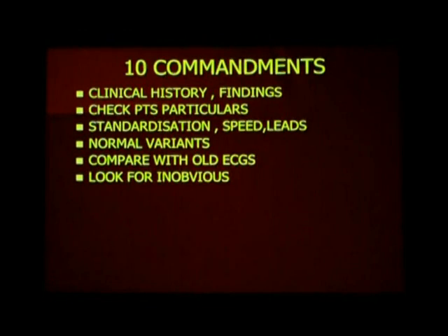Obvious is obvious, look for the inobvious. So the ECG reading dictum is you must not look at what others will diagnose. You must always look at what others will miss. So when I see an ECG, I see what others will miss and try to diagnose that rather than looking at those things which all others will diagnose.